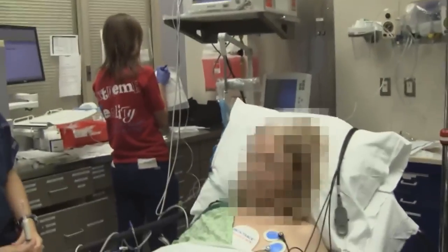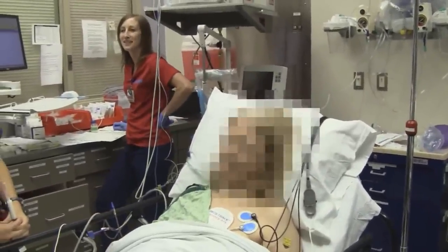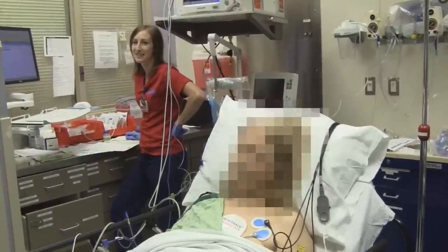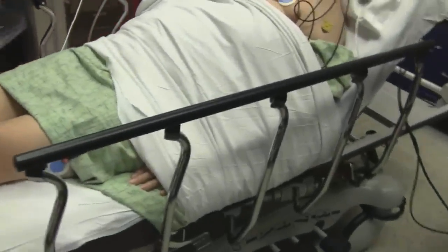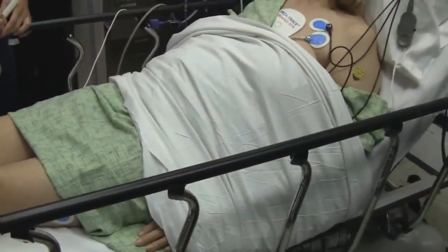Our cardiologist is standing here at the bedside leading and directing this procedure. Do you have any words of wisdom? One learning point: we like to tuck in patients' arms gently, so that when they're cardioverted their arms don't bump up and minimizes the risk of hand or finger injury on the side rails. So we're going to tuck you in snugly — just to help prevent the fingers from flopping up. You'd be surprised.